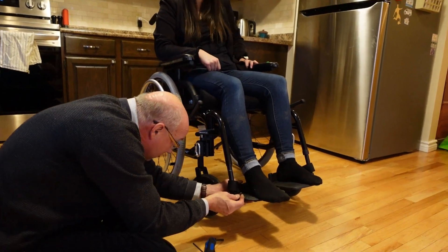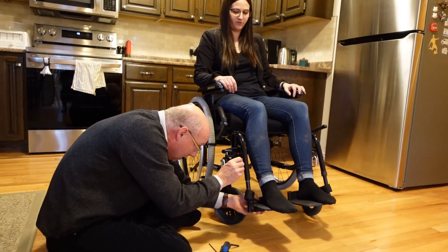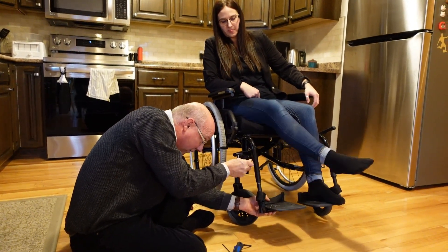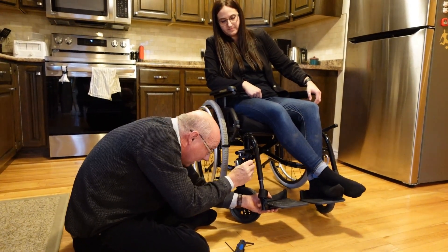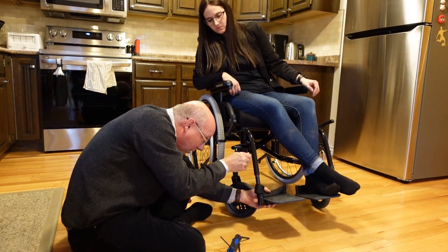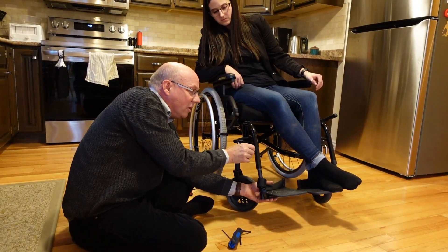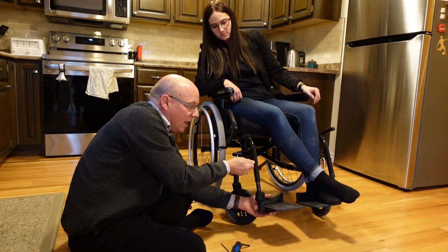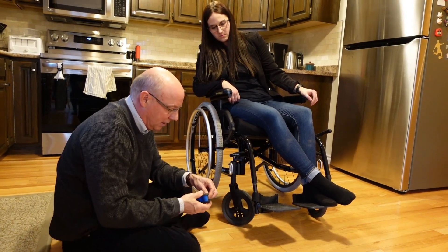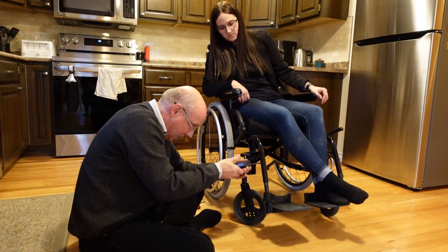How does that feel? Right about there — yeah, it's good. If you can just take your foot off for just a minute, we'll get this bolt on. You have to line the hole — that's probably the hardest part. Once you line it up, you just thread it in by hand. Now at least you'll reach the heel loops. Take the Allen key again — the proper one — make sure it's tight, there's no slack. Tighten it up.